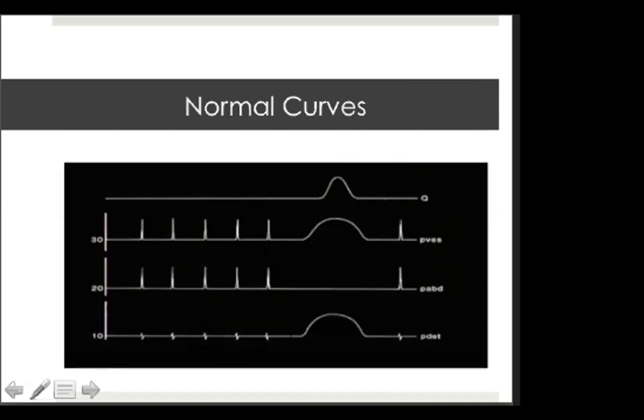So during, for example, this is the voiding, if we give the patient the permission to void... Sorry, what is this graph?